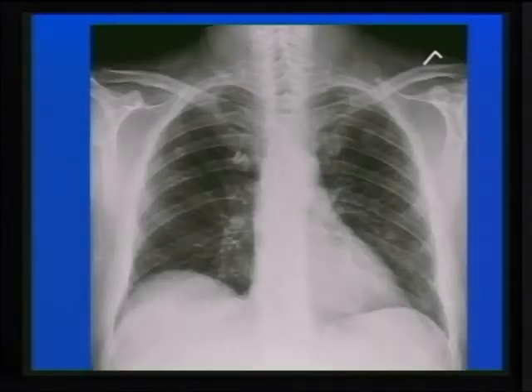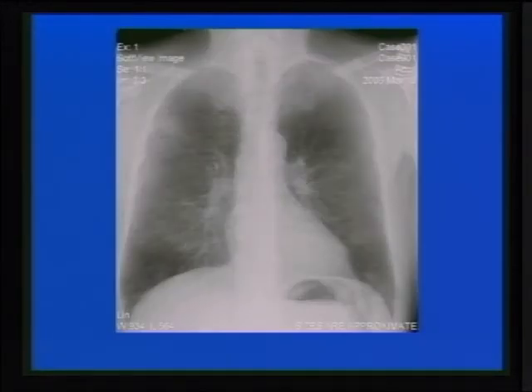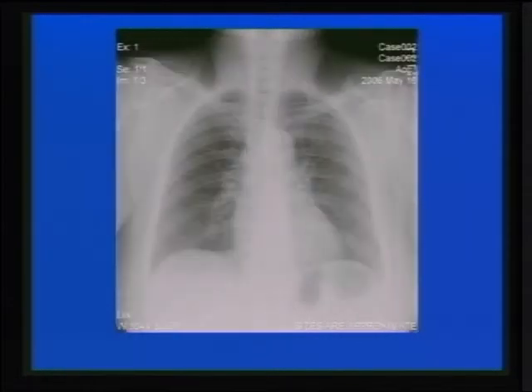The other thing that we're playing with and that still has some promise is tomosynthesis, and so you're basically going back to the old concept of linear tomography, for which you can section through the lungs, and then you can see this patient with metastatic disease. But I think the one that is promising is this bone suppression technology. This is post-processing, and you can see lesions better once you remove the ribs, but you remove them in a digital format. So you're not re-exposing the patient, you're not doing linear tomography. So you can see this lesion in the right upper lobe much better than what you had before when the ribs were overlapping the lesion. Do you see the lesion here?